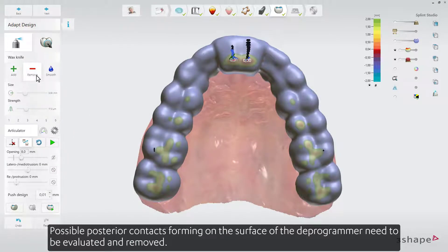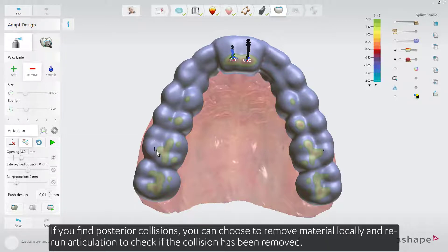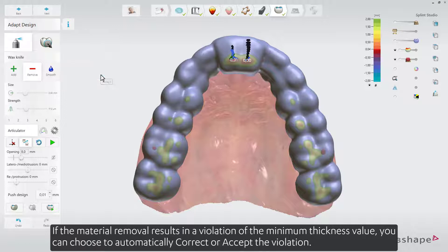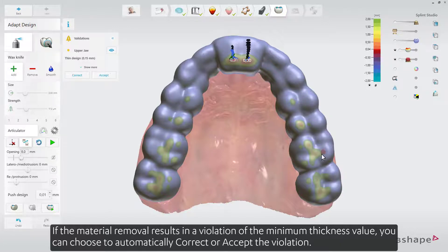Possible posterior contacts forming on the surface of the deprogrammer need to be evaluated and removed. If you find posterior collisions, you can choose to remove material locally and re-run articulation to check if the collision has been resolved. If material removal results in a violation of the minimum thickness value, you can choose to automatically correct or accept the violation.